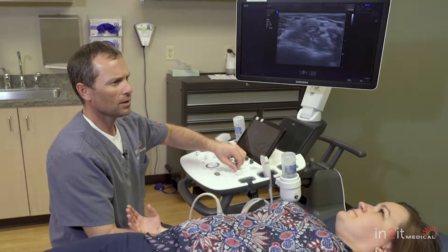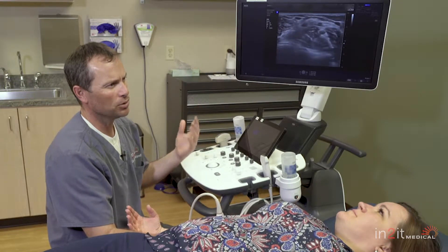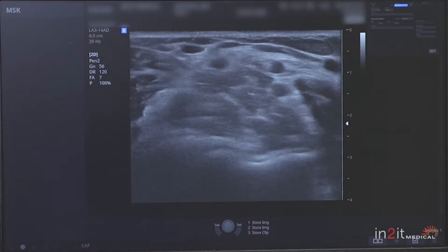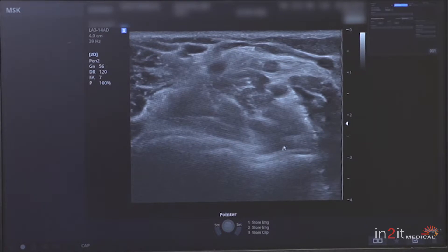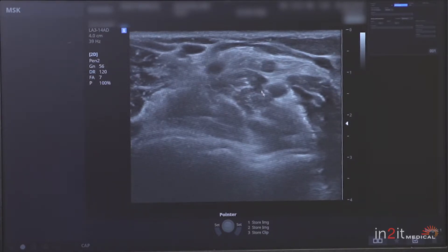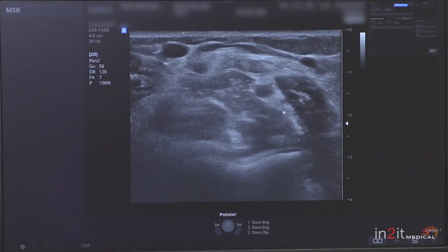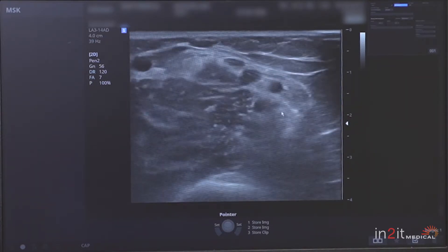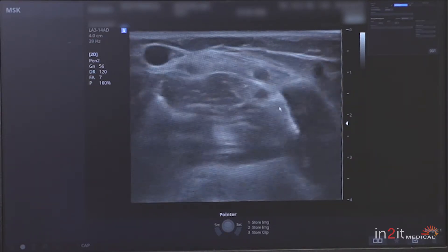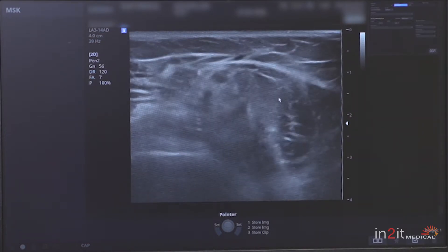This is an ultrasound — in this case we're looking at the anterior elbow, or the elbow joint from the front side. The first thing we notice is we can see all the way to the bone, which is down here. We see the scalloped appearance of the bone, and on top of it we have a muscle called the brachialis. Next to that we have the brachial artery, and right next to that we have the median nerve. We can actually see it very well as we scan up and down through the arm.